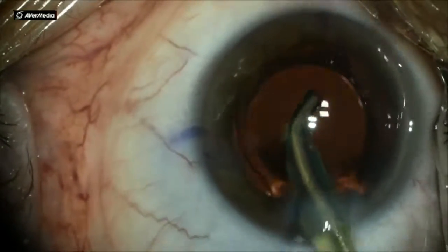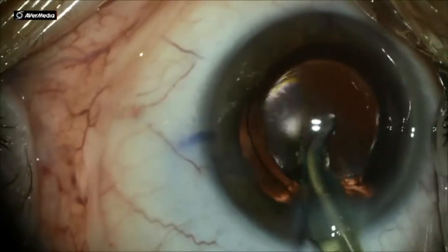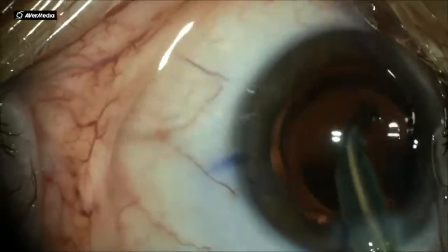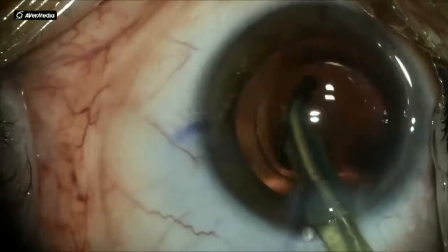What I do is I tap on the optic and I actually rotate the implant at least 160 to 180 degrees, if not 360 degrees.